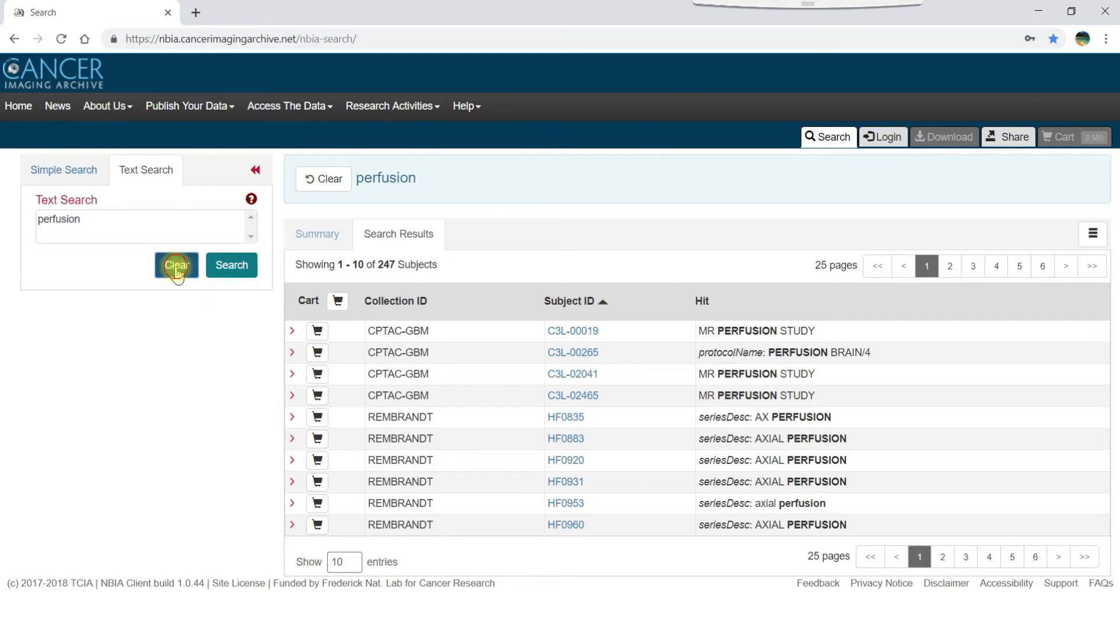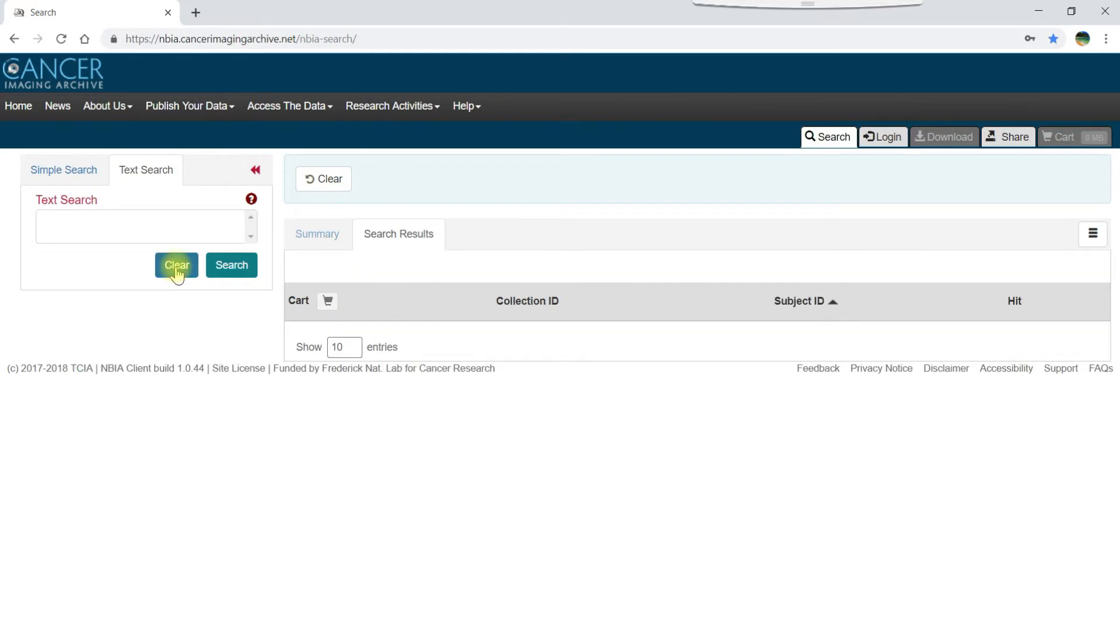Let's click clear to start over and then enter the DICOM tag name, series description, followed by a colon, no space, and then the word perfusion.